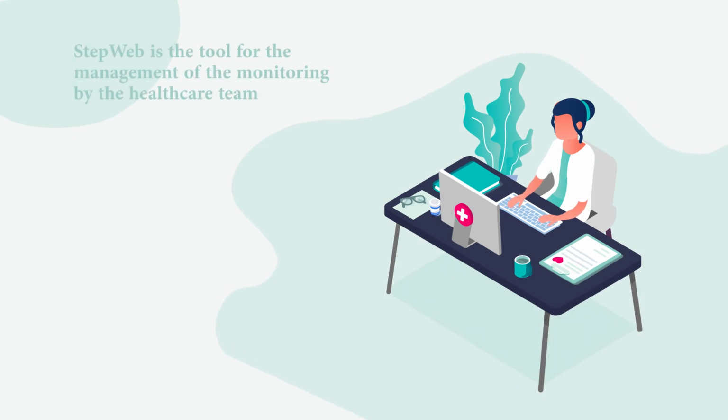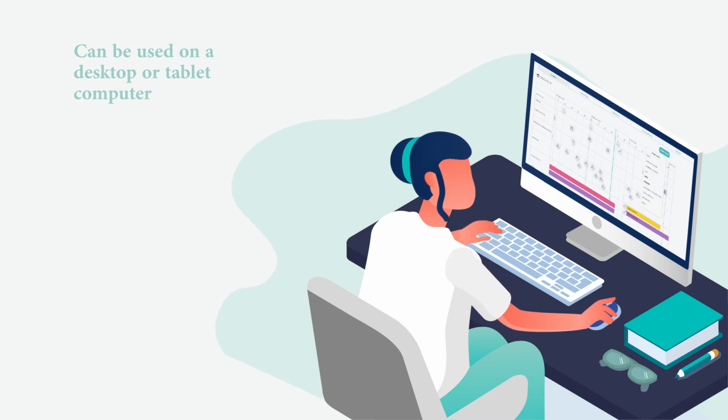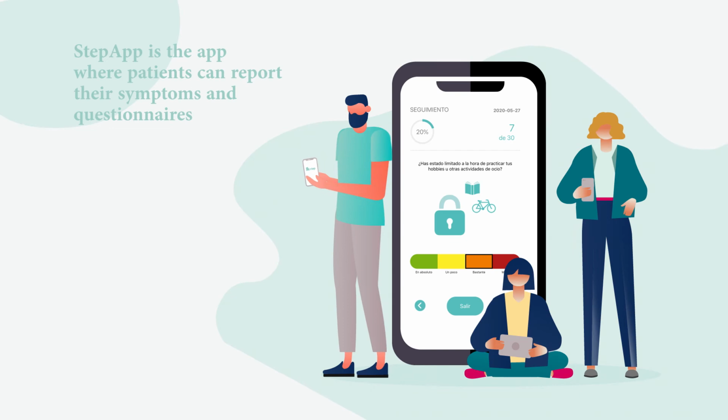STEP Web. It is the computer program with which doctors and health professionals monitor patients. This is the management tool that we're going to use in our work, either from the computer or from the tablet. STEP Web is a very visual, intuitive, and easy-to-use program. The creators of STEP have put a lot of effort into studying our needs and designing a tool that perfects and makes our work easier. Finally, there's STEP App, the application for mobile devices that patients will use to complete their questionnaires remotely.